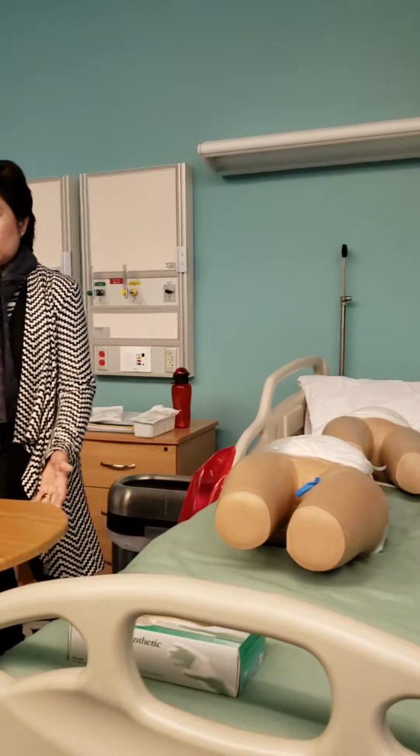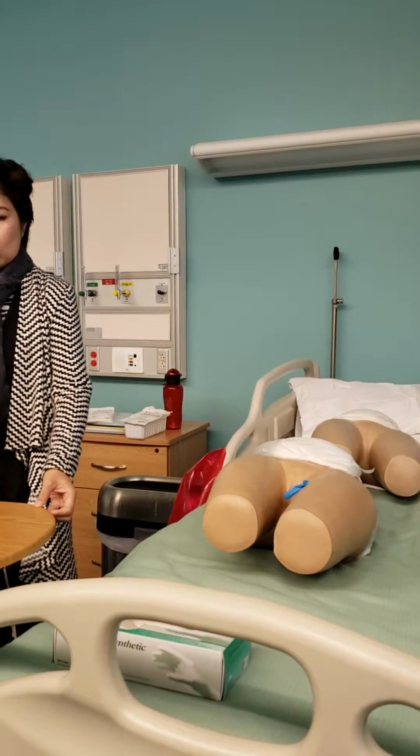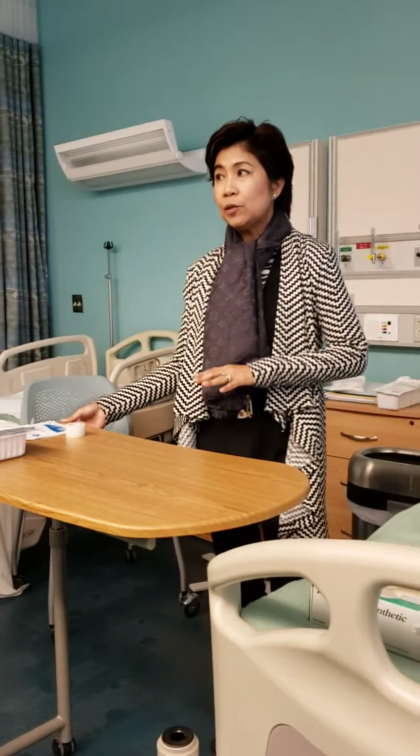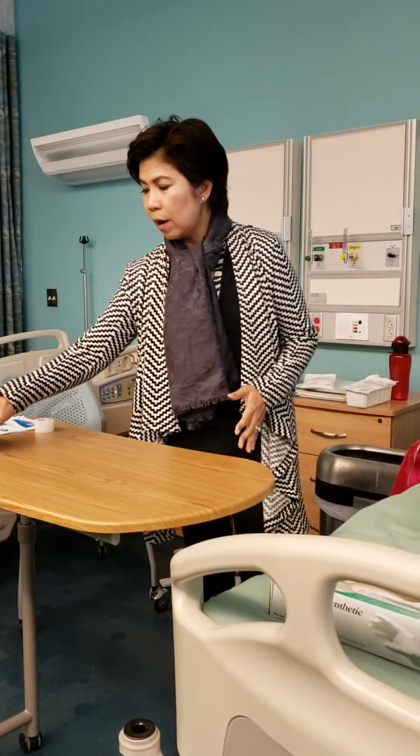And then I put the bedside table waist high, because with the sterile field you want it always waist high. And I cleared the table to where I can put the sterile drape here. Okay.